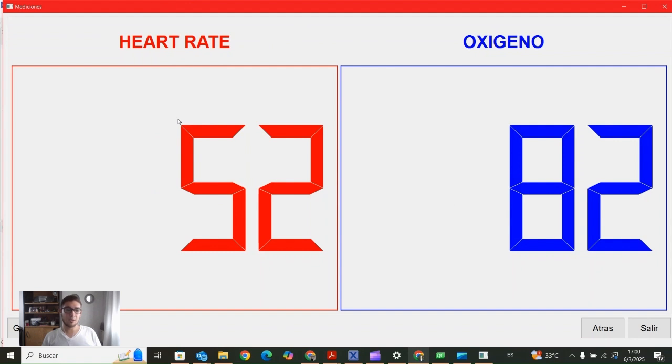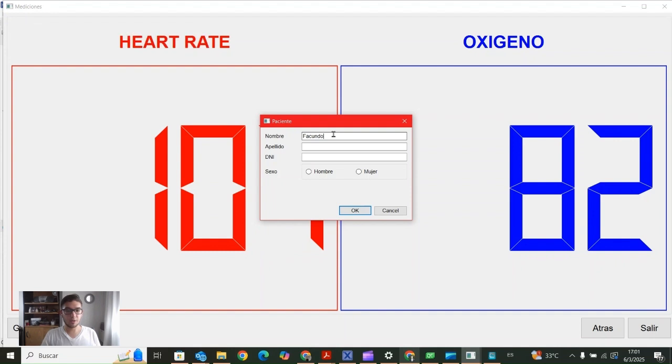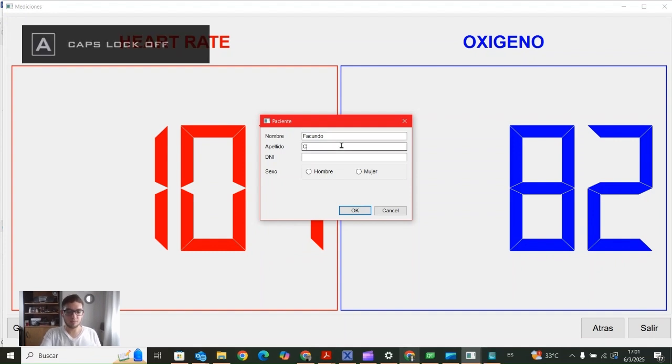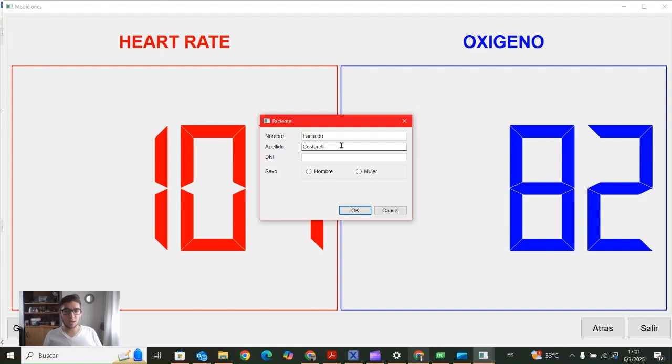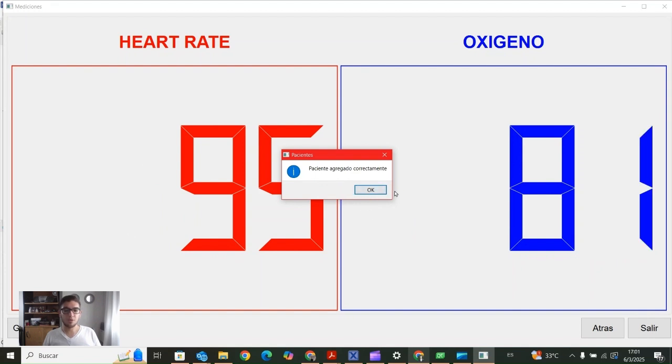But now, just not to wait too much, suppose that we want to save these measurements. We are going to click on save. We are going to put my name, for example, Facundo, a surname, and well, my national identity. Well, the sex, and okay, we saved data related to a patient.